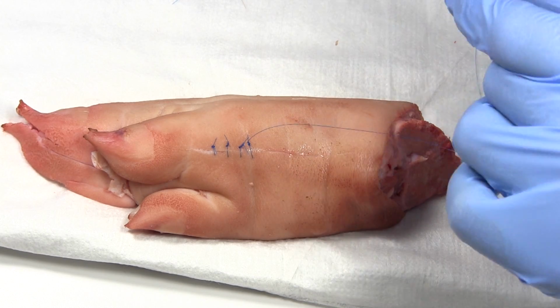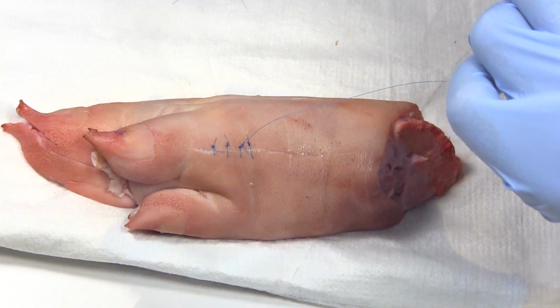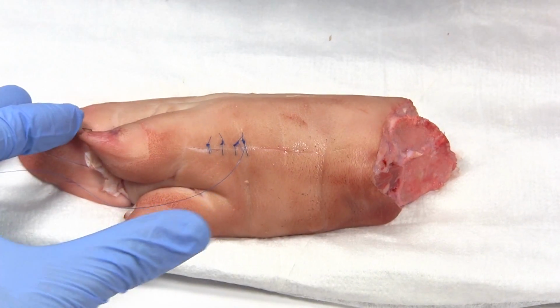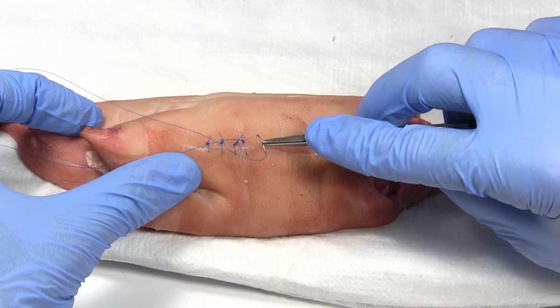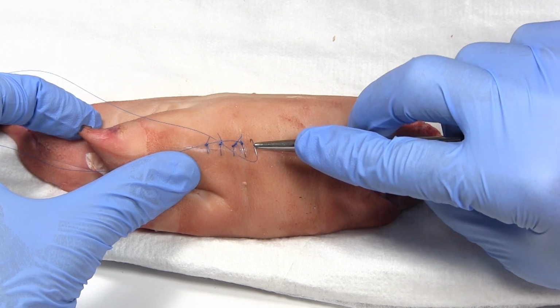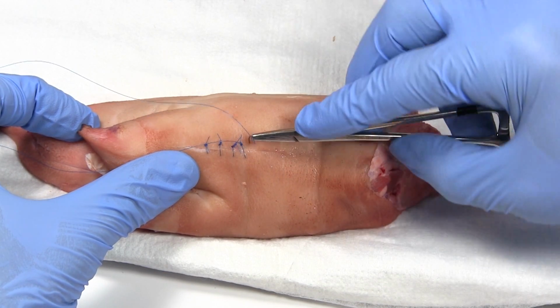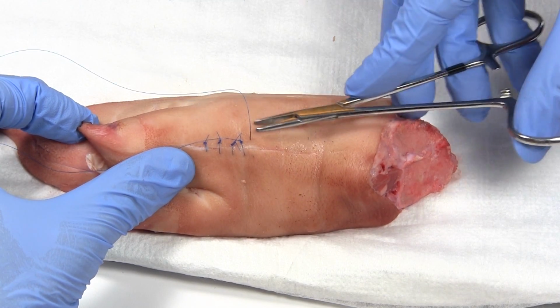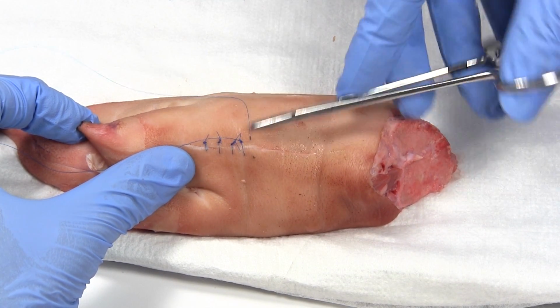Now here's where it varies a little bit for the running suture. Put the second one in, and you want to go just a little bit to the side of that first one. Come across, out the other side, and pull it through.